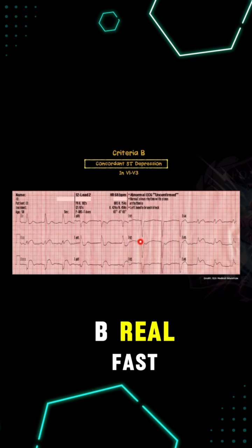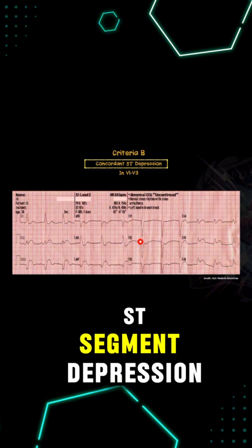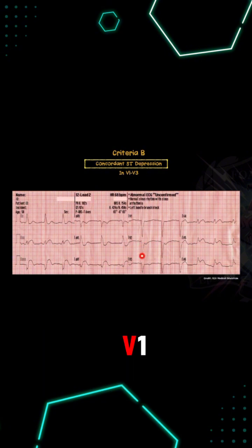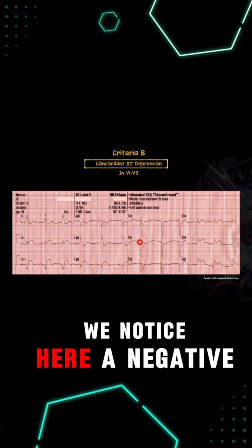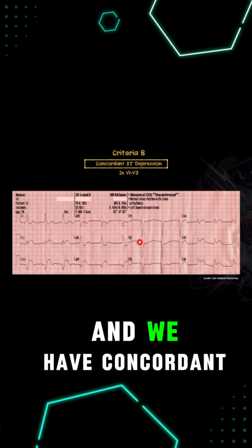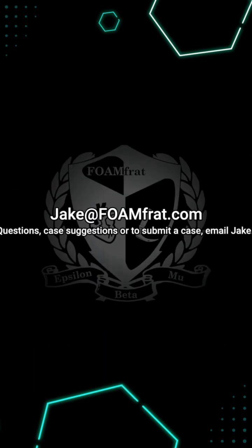Let's talk about Criteria B. We're looking for concordant ST segment depression, and this is specifically in V1 to V3. We notice here a negative deflecting QRS and we have concordant ST segment depression.